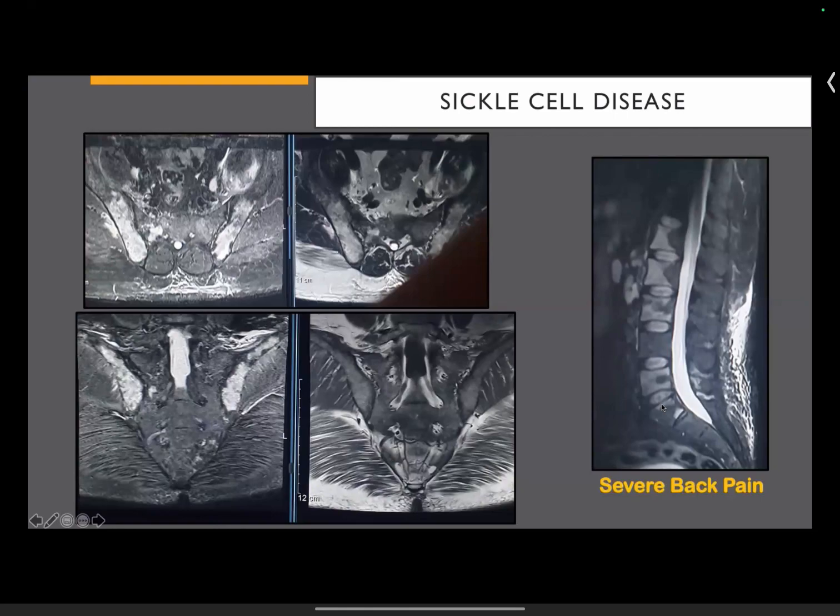The other thing is, follow-up is a great helper. If we are not sure, you can follow up with an MR in a couple of months' time to see what's happening. Infarcts will usually show variable resolution, and metastasis will probably show progression if not treated. So it can be tricky. I don't have a right answer for that. It's just the morphology and the context.